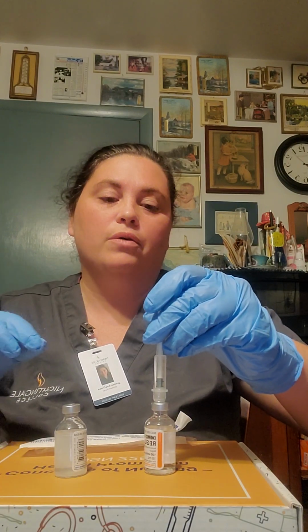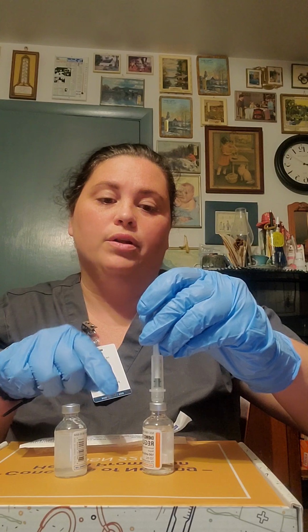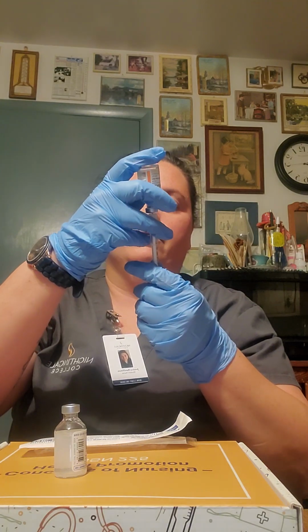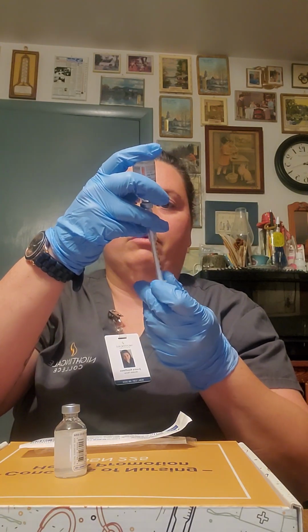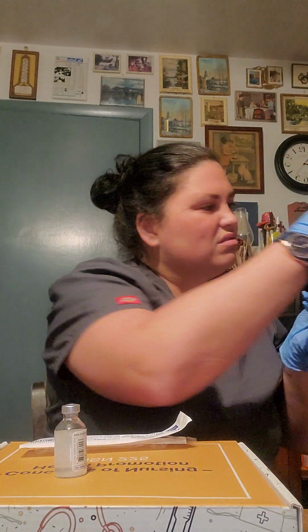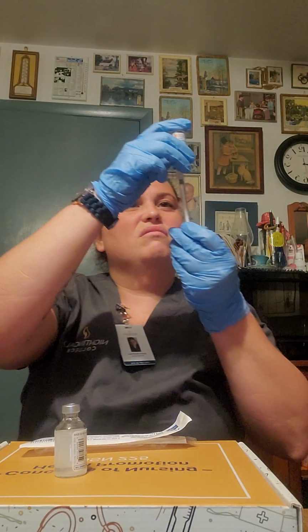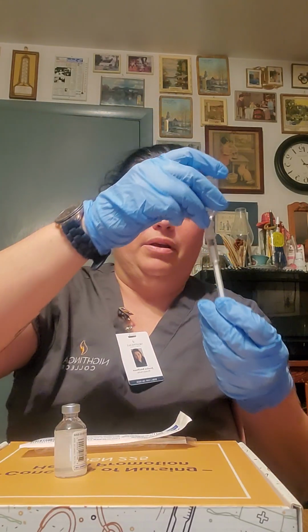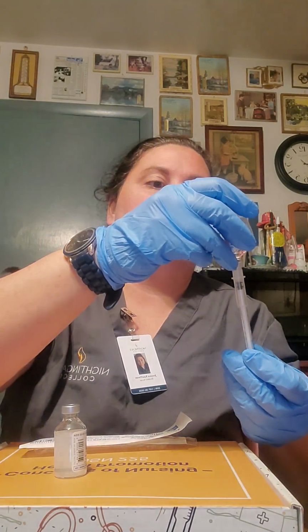Okay, so since this is 4 units, I now can invert this, and I'm going to withdraw 4 units. It's hard to see in here. Okay.